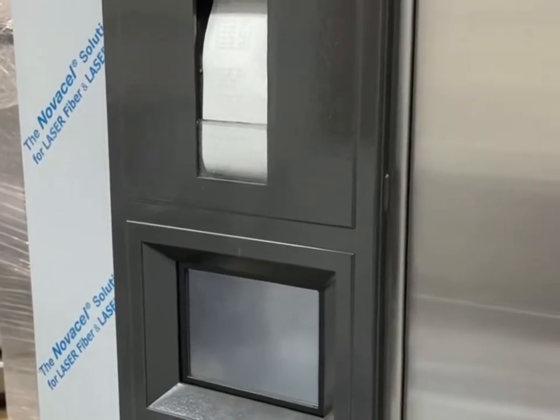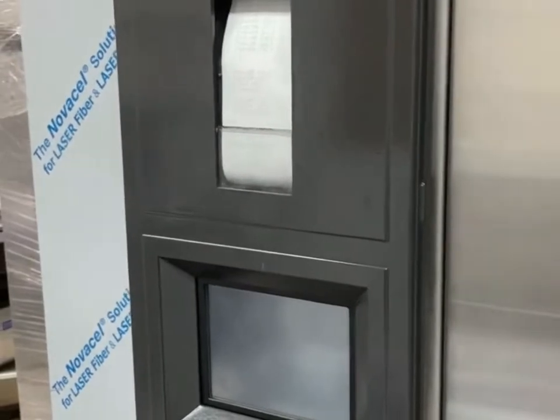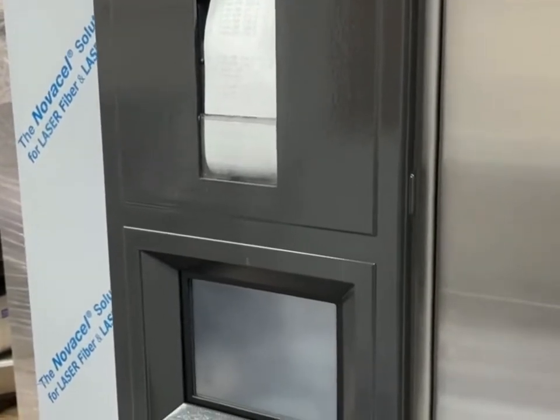Today we have a STERIS Century sterilizer. This is a typical STERIS Century control on both the small and medium sterilizers, covering everything between a 116 to a 160.